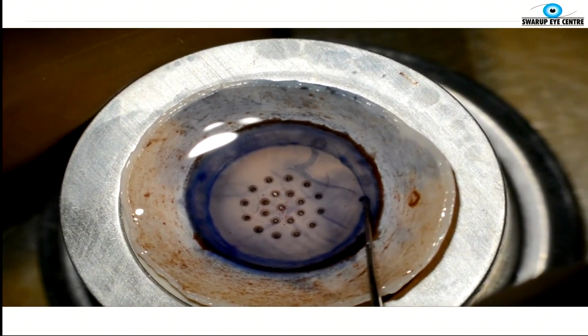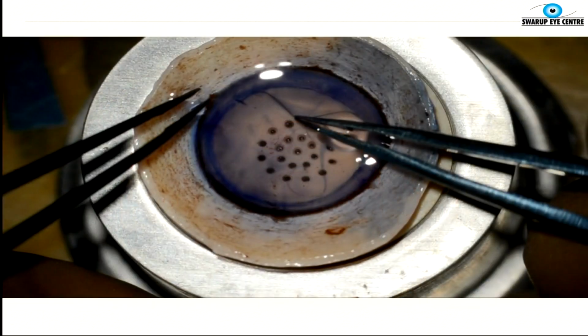It's a good idea to go all around and lift this Descemet's up, because when you punch, that Descemet's membrane gets tucked into that groove. So if you don't lift it all around, sometimes it can get stuck. Then you use a non-toothed forceps. In this case, I'm using a curved suture type, but you could use any blunt-tipped instrument, ideally one which has a broad tip, so it can grasp a larger amount of Descemet's membrane without traumatizing it.